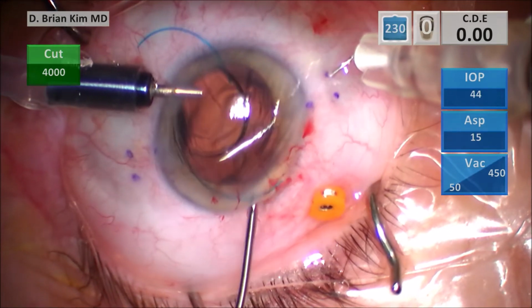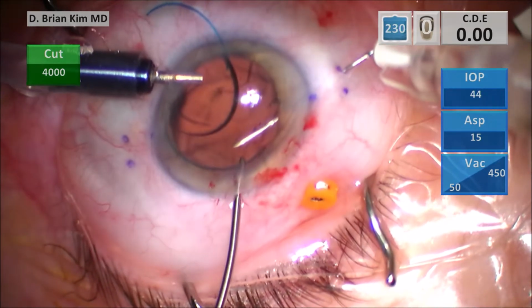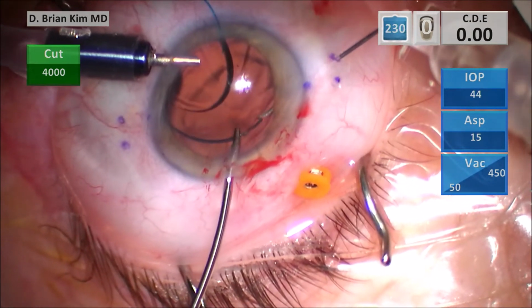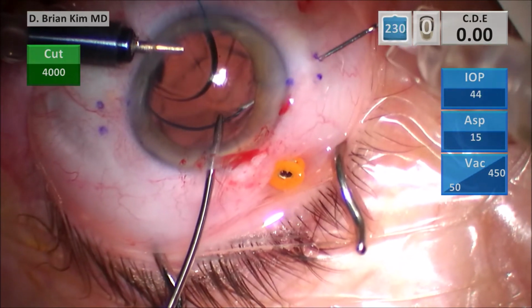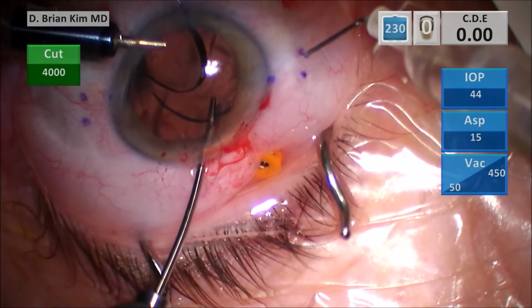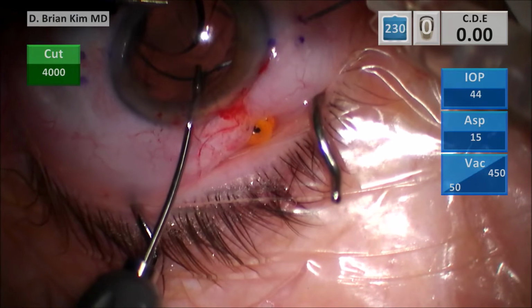And very carefully, this is very, very important. As you grab the haptic, you don't want to have a heavy hand. And you want to slide it over as you put it through the incision. Infusion is on when I place the needle through the sclera. You want to dock the haptic on the bevel of the needle, as I'm doing here. And it's all about angling. And so you want to be very delicate touch as you flatten out the haptic and then gently feed it through the needle. Very important that you have a delicate hand when you do that.